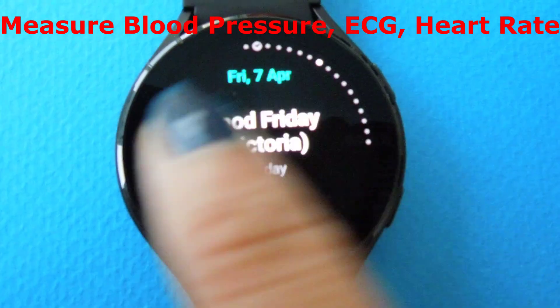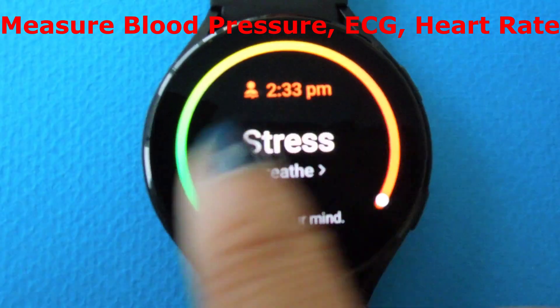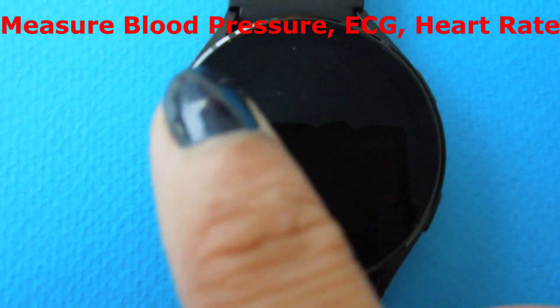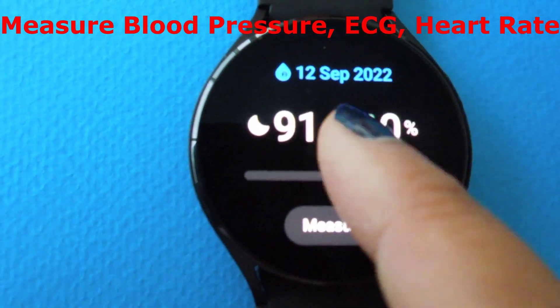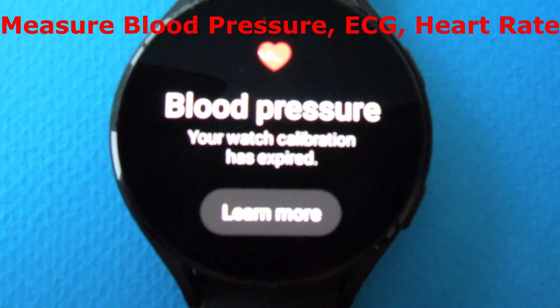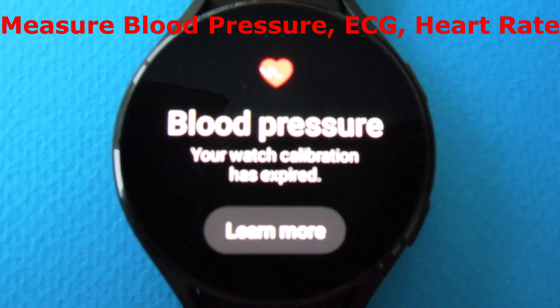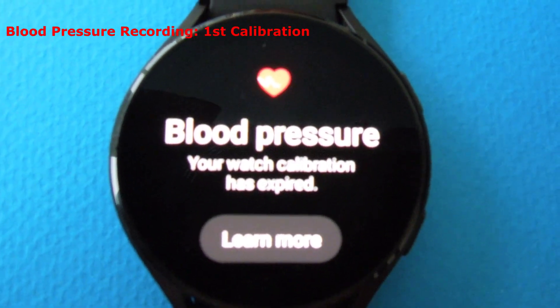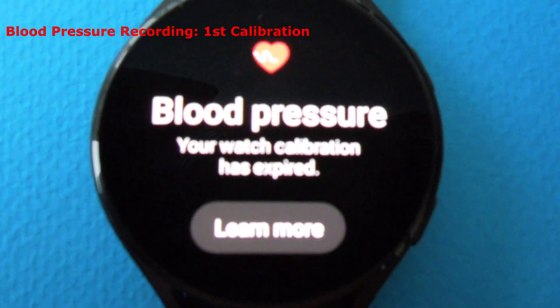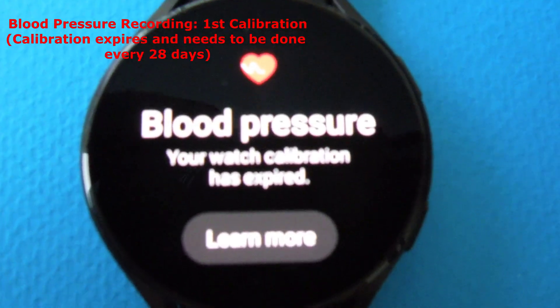To measure blood pressure and ECG, I'm scrolling through my smartwatch to get to the respective screens. Here I'm navigating to the blood pressure screen — this is the screen used to monitor your blood pressure. It's currently saying that my watch calibration has expired.